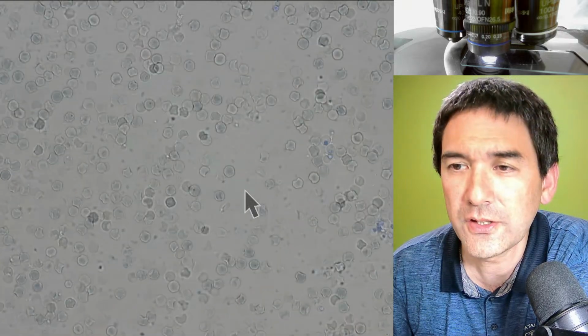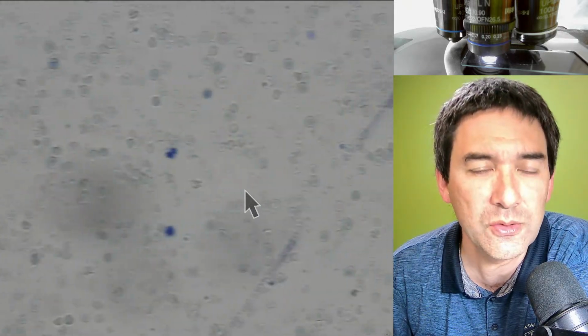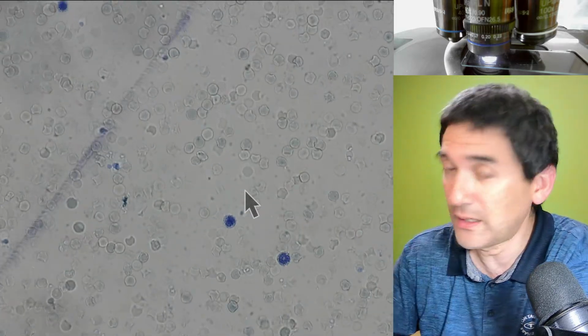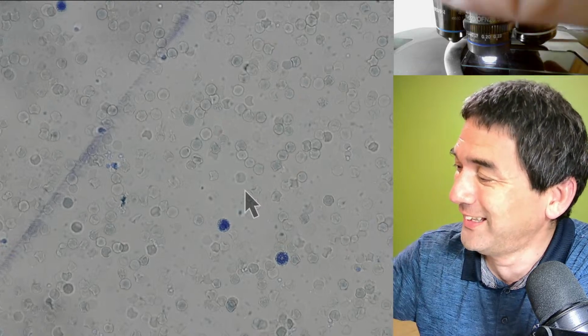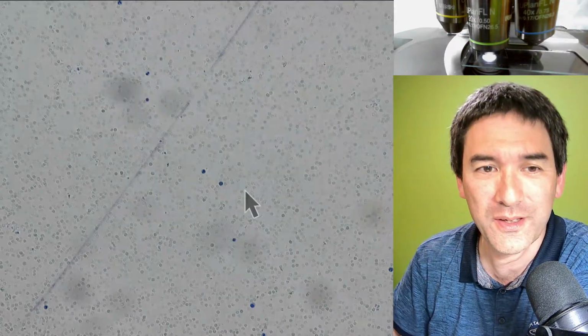So let's try the following. What time is it? Okay, around 15 minutes. And then I would like to answer some of your questions. So what I'm going to do now is I have to again prick myself, unfortunately. And I would like to then try this with some fountain pen ink.